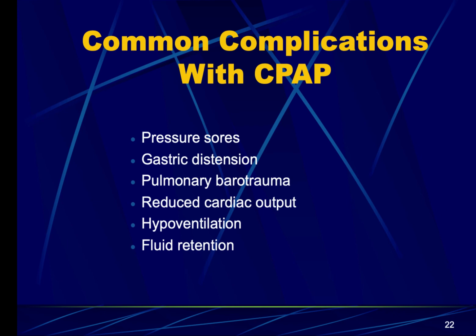Obviously, reassessing in between increases of levels of PEEP. In the field we usually start at about 5 centimeters of H2O for PEEP, and we can go all the way up to about 10 with the quote-unquote normal street medic. When we start getting into actual critical care medicine, we can go up a little bit more, but that's besides the point. We're going to stay where you guys are at now.